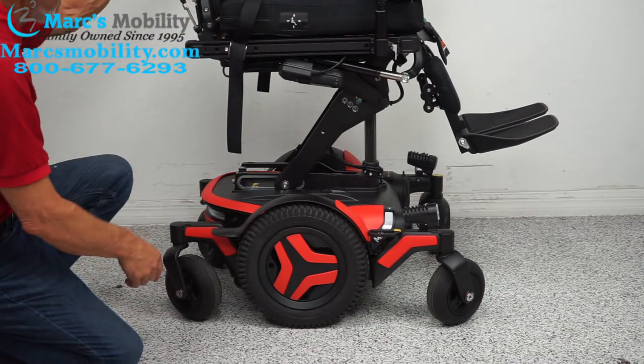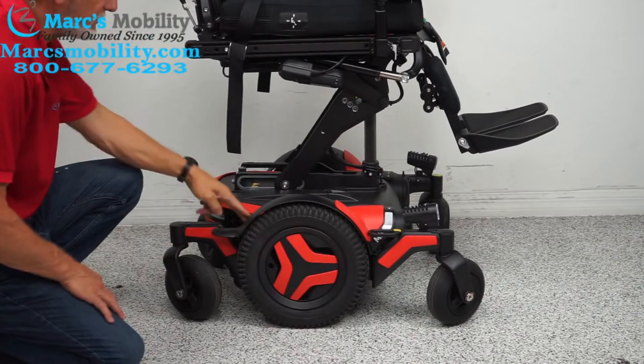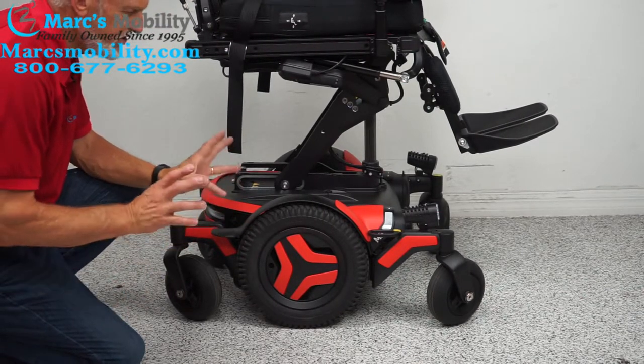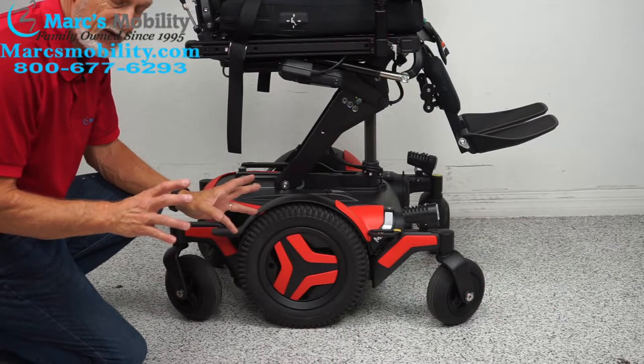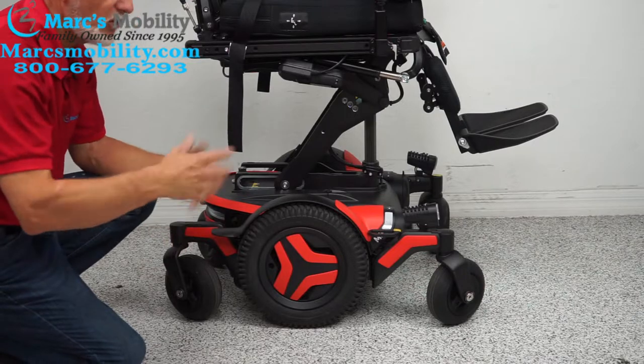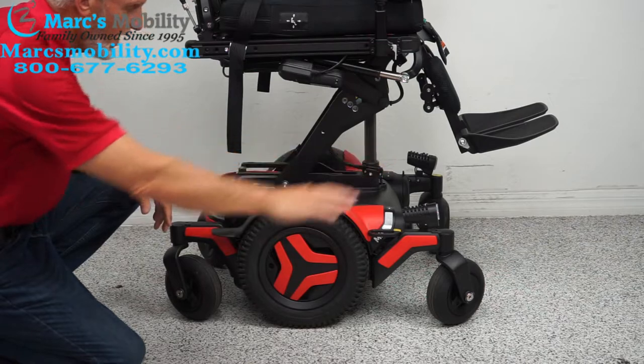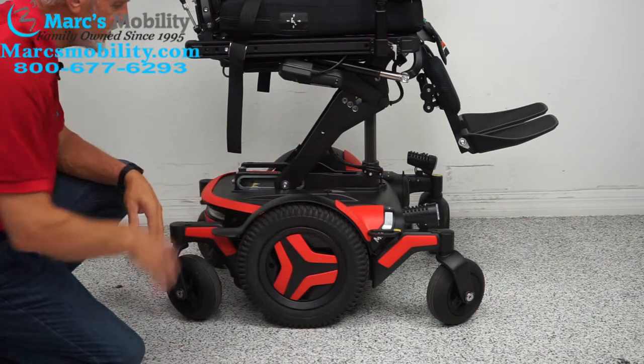There's suspension back here — you can't see it, but you can see the fork moving. There's a huge suspension back in here. This chair weighs about 425 pounds, so with the weight of the chair and a 200-pound user, that's over 625 pounds of weight. That's why you get such a good ride — it feels like you're on a cloud with these chairs.